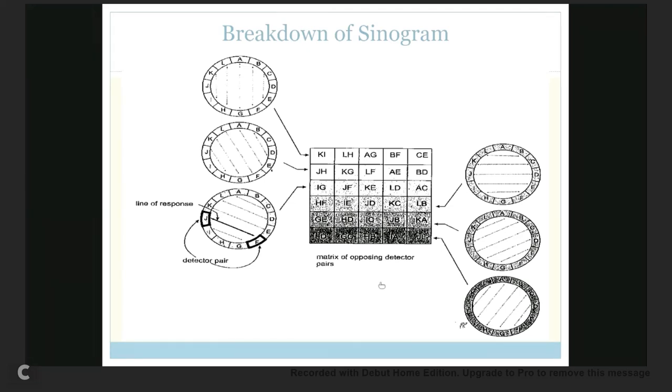You sure? Because I know with the gamma camera, it was quadrants 1, 2, 3, 4, and then you have to do all this subtracting, and then it goes into the X position, and then 1, 2, 3 subtract, and then it's the Y position. This is totally different. Basically, A and G go together, and then J and D go together, and then these go together, and those are what make up the little matrix. Okay?